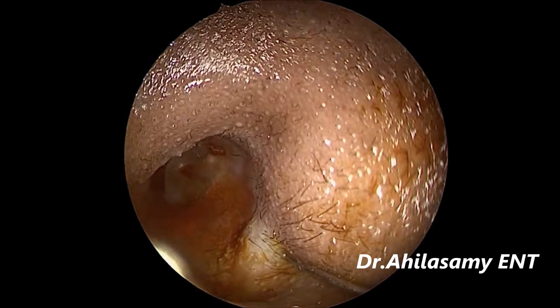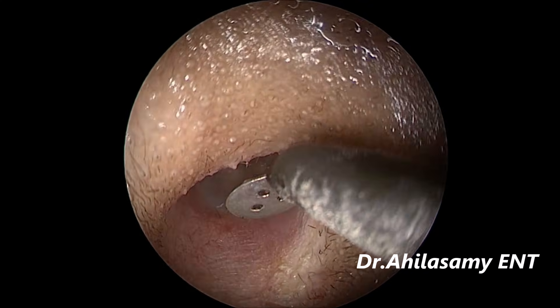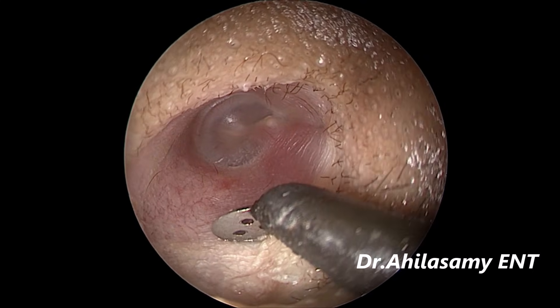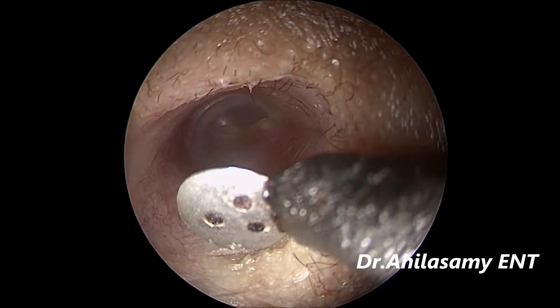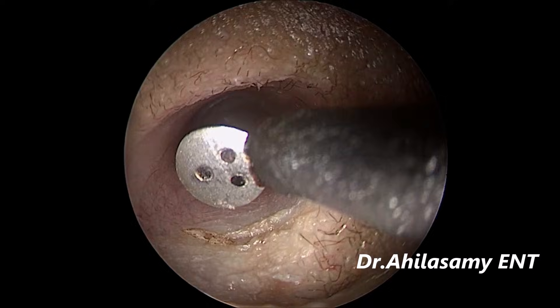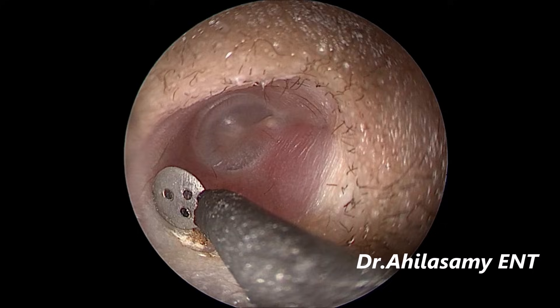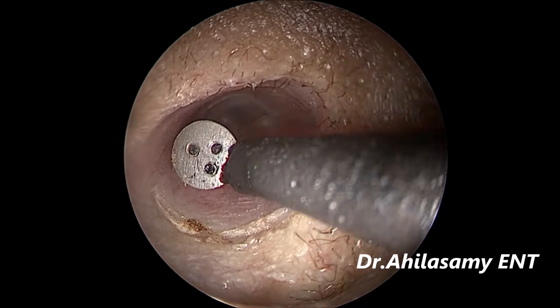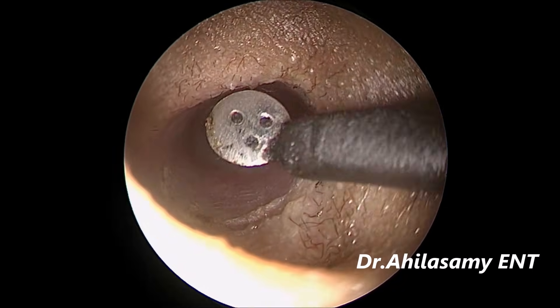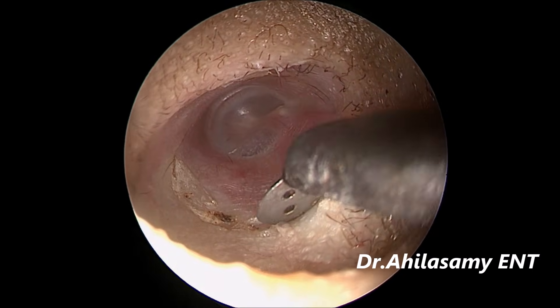Under local anesthesia, the first thing is to give an infiltration at one or two places with a 23 gauge one-and-a-half inch needle. Then making an incision with my own innovation, Dr. Aghila's endoscopic diathermy knife. Then I will be showing the elevation — how it is bloodless usually — with the single-handed endoscopic elevation of the tympanomeatal flap, which is a nightmare sometimes. So you can appreciate how the field looks with my technique.